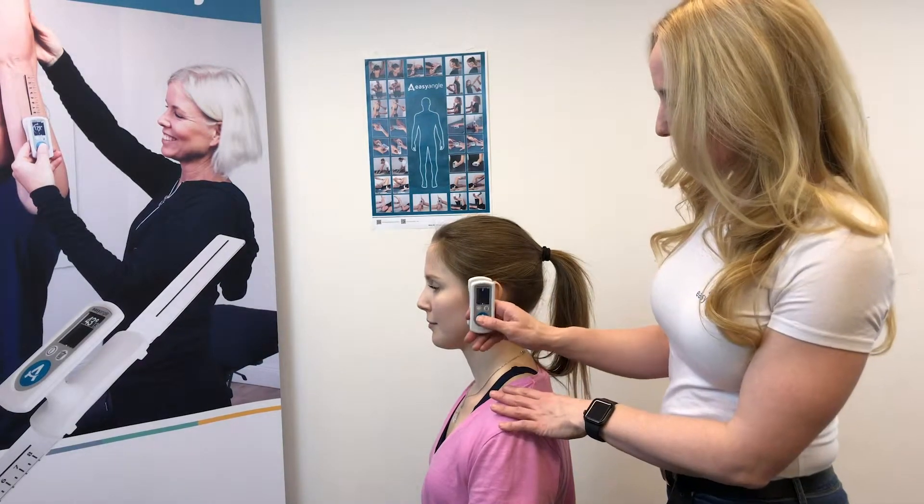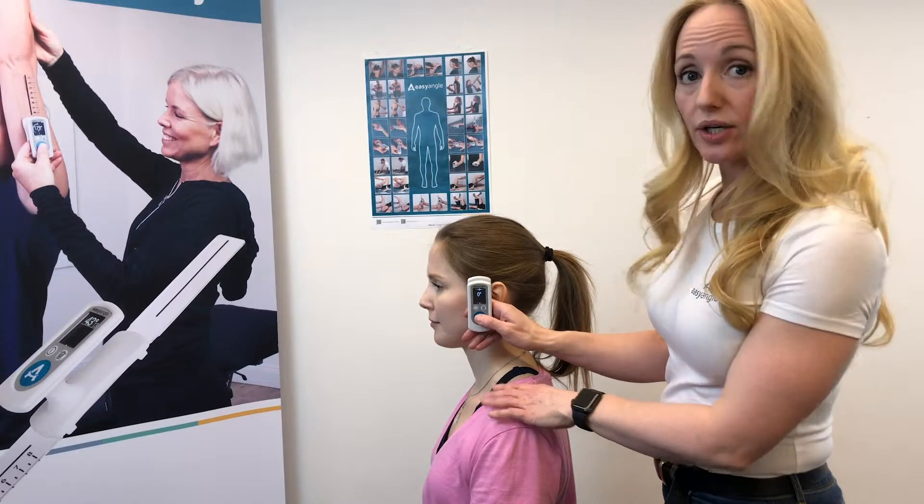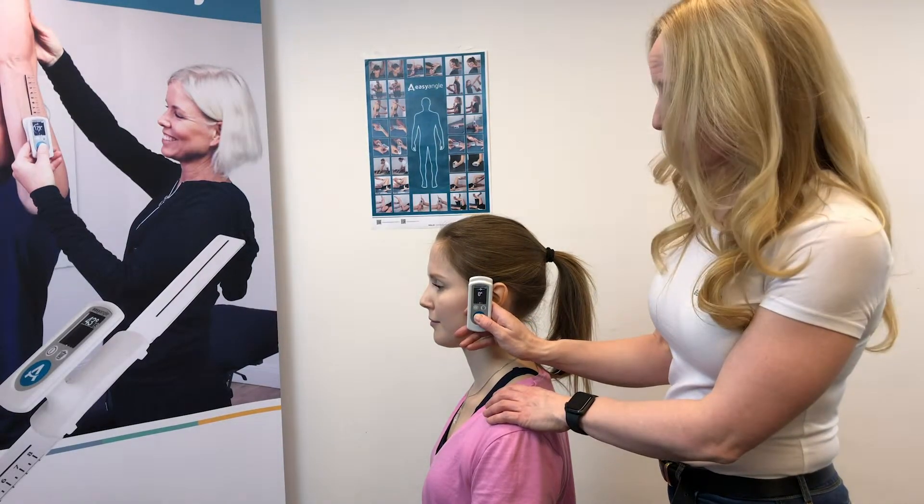For this measurement, we will align the device with the patient's ear. Just keep a hand on the shoulder to make sure that they're not moving the shoulders forward.